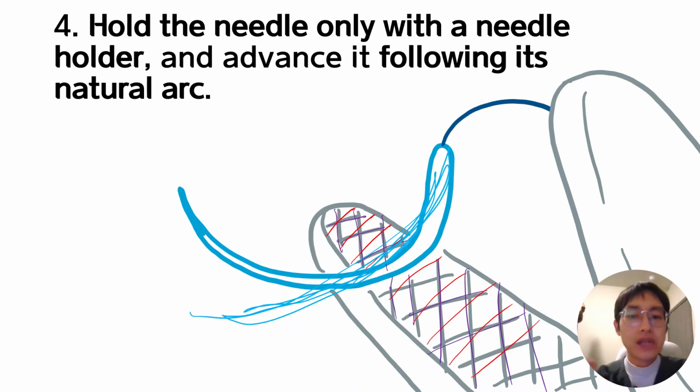So when you are reaching further back, it will be challenging. So don't suffer, use the right instrument, make yourself and also the patient comfortable.